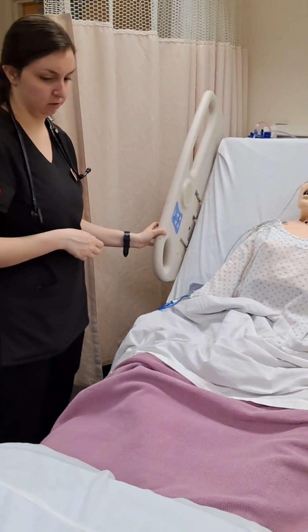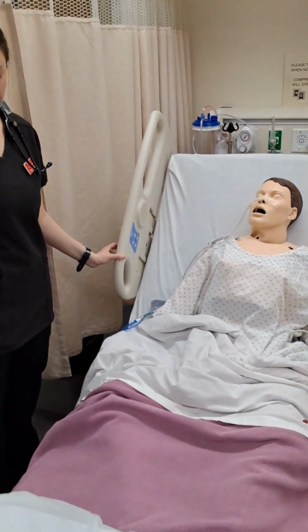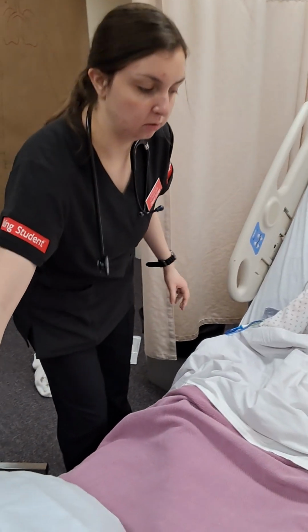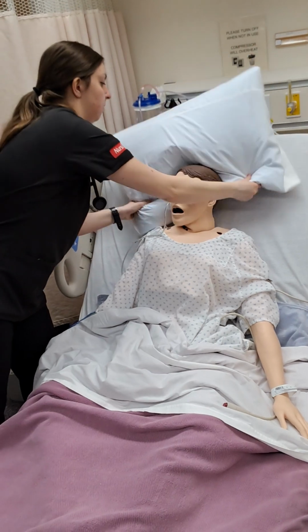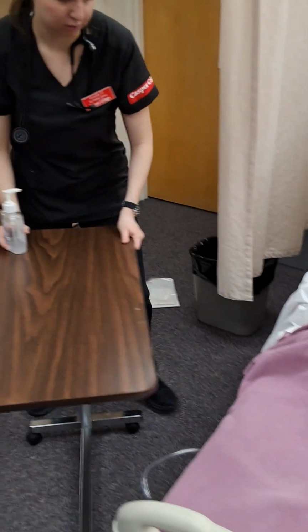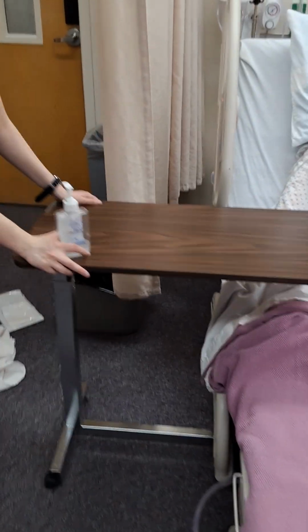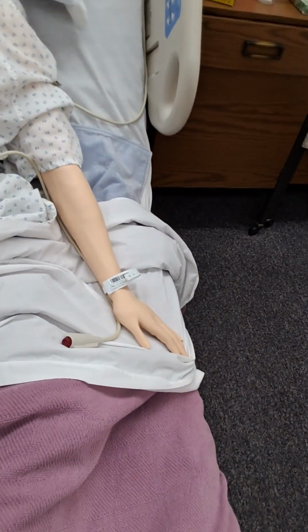I'm now going to make sure my patient is in a safe position. The bed is in the lowest position. I'm going to put this pillow behind his head. His personal items are within reach. His call light is right there by his hand. I'm going to check the brakes of the bed.